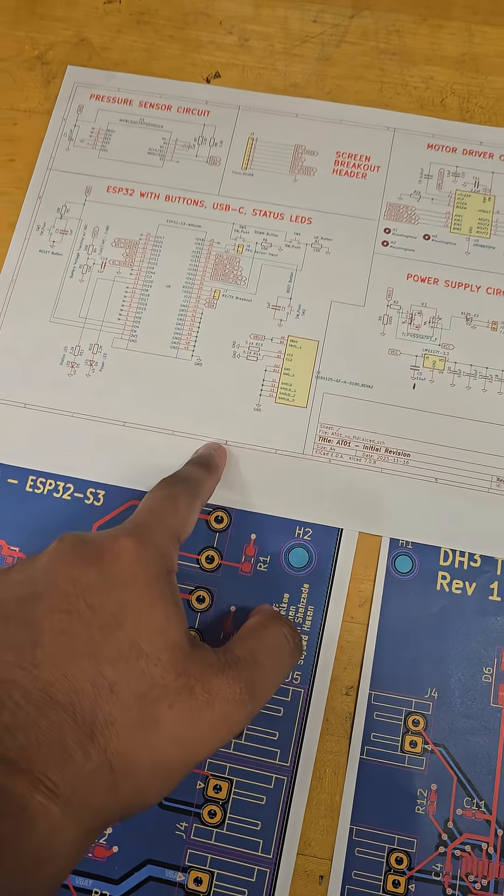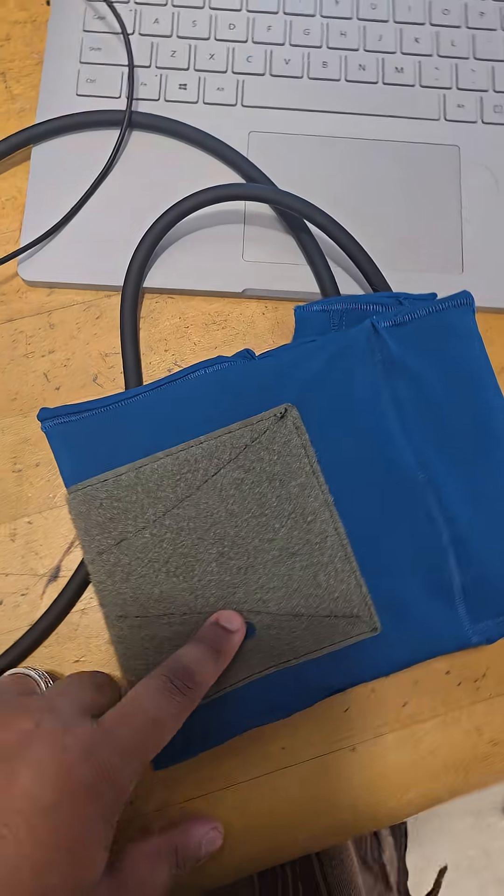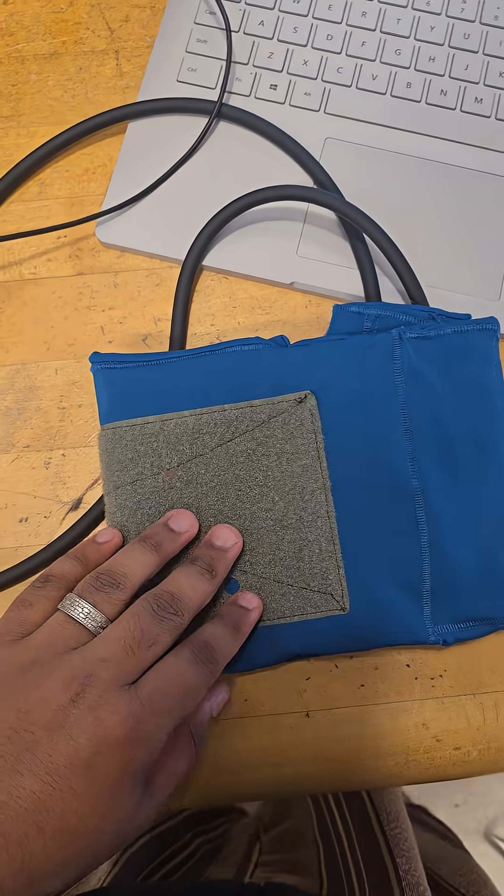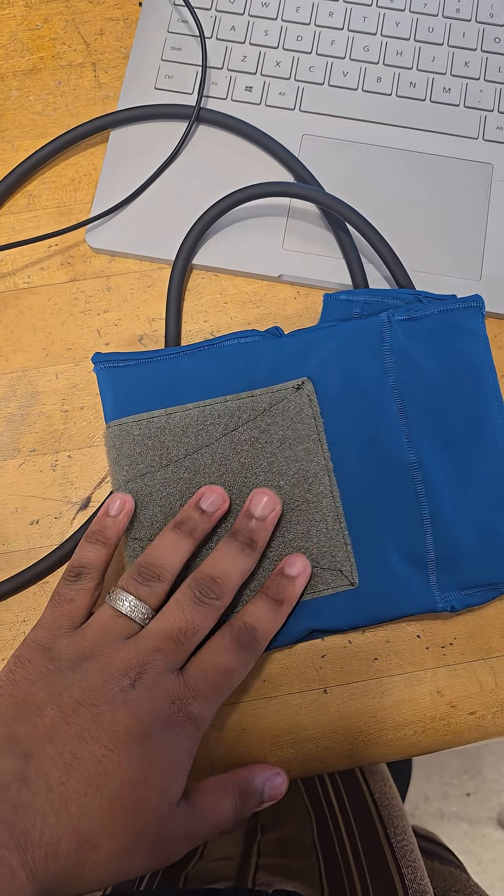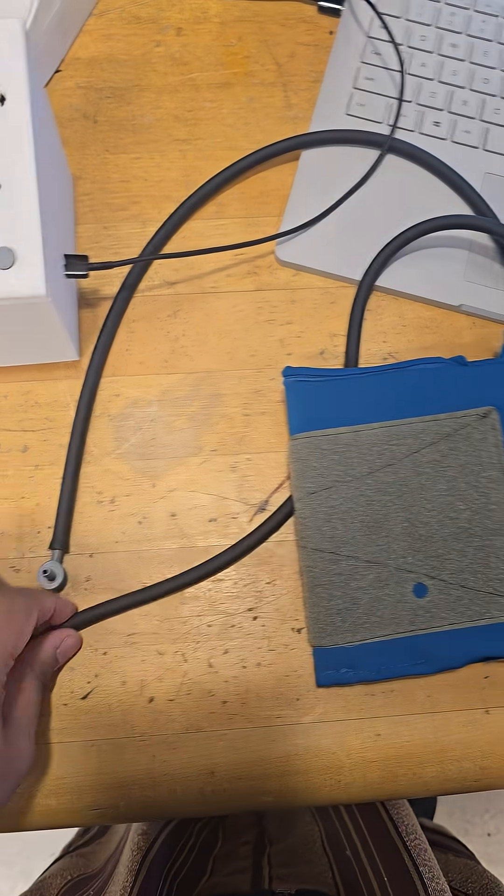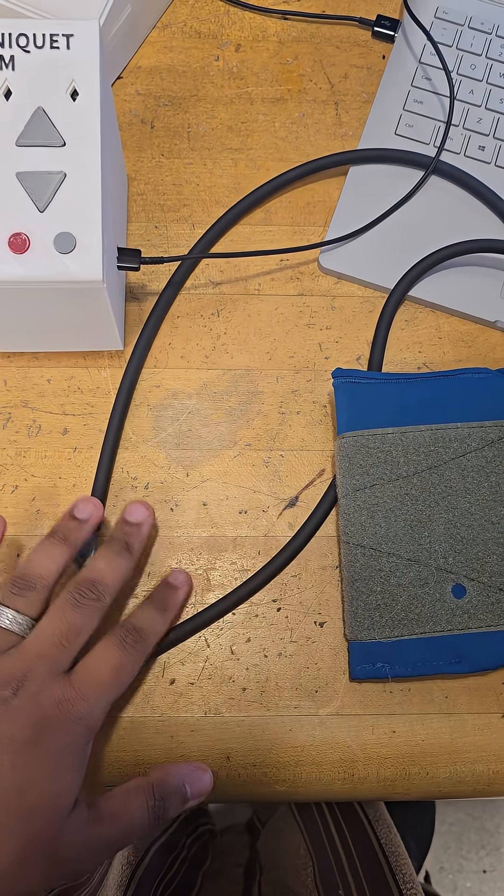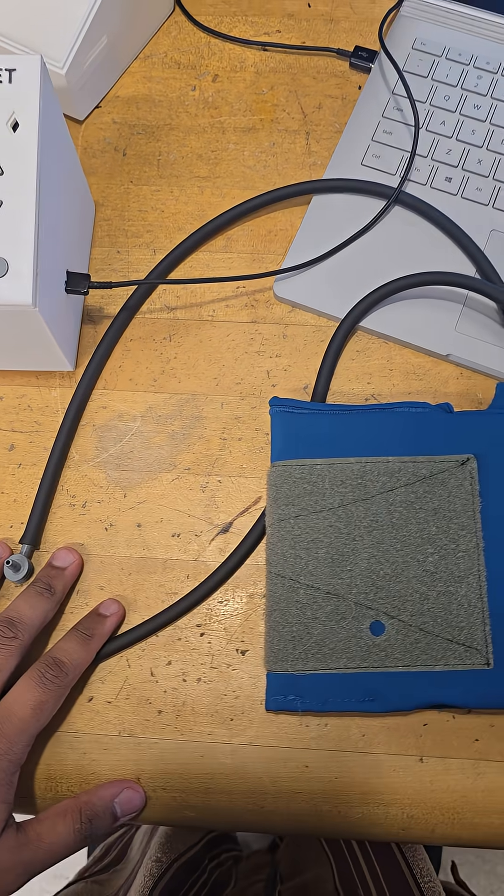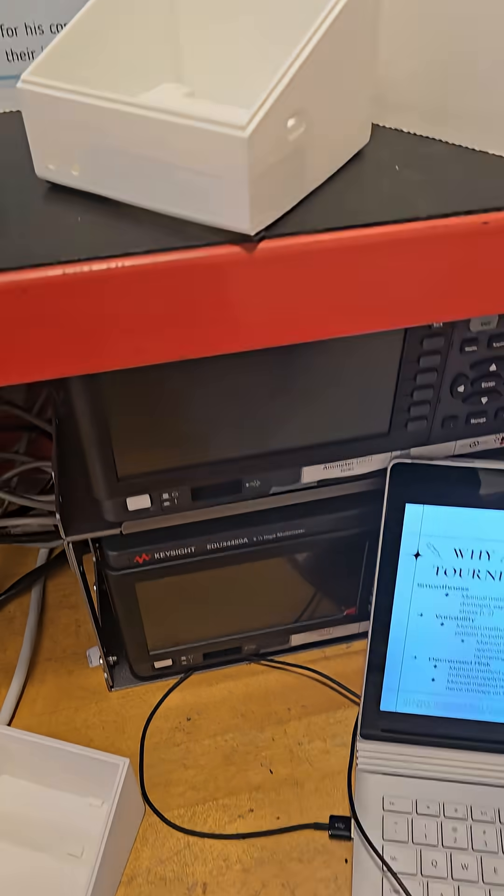This is the final version of the circuit. This is the actual cuff that we put on the patient, and these are the lines for the air that flows in through the device.